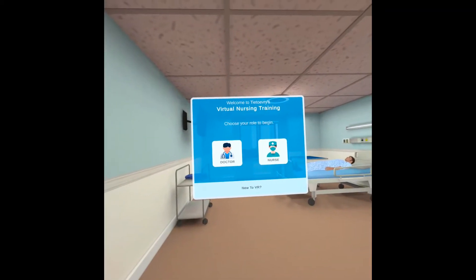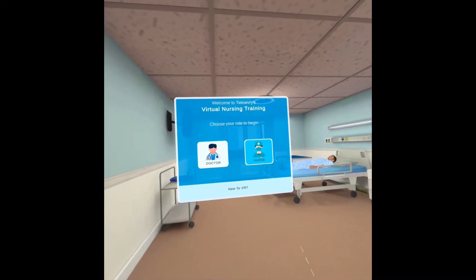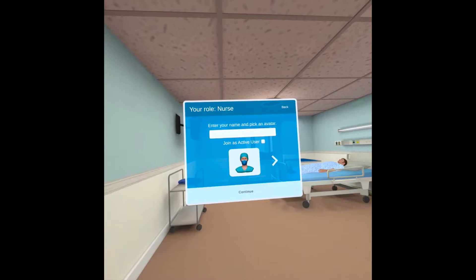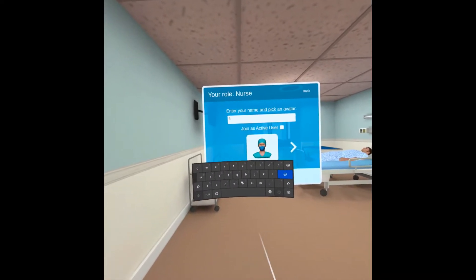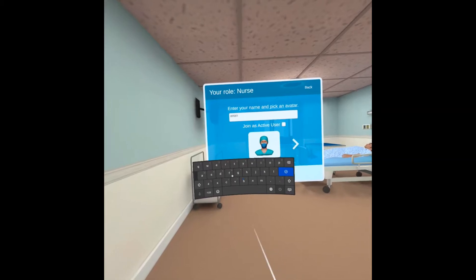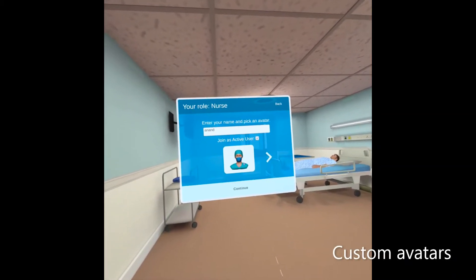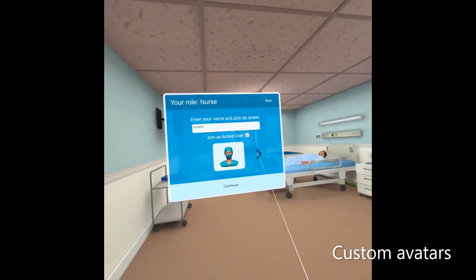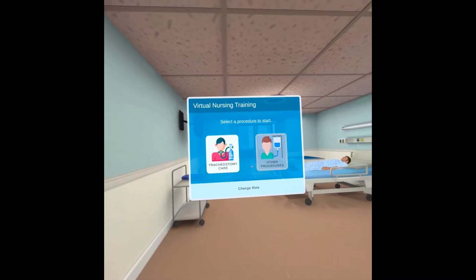Welcome to Tietoevry's virtual nursing training. Please choose your role to begin. Enter your name and pick an avatar. Select a procedure to start.